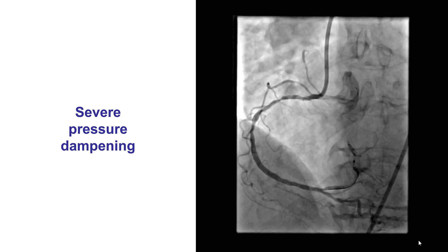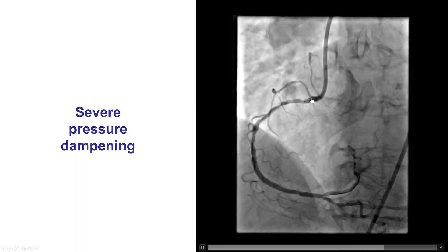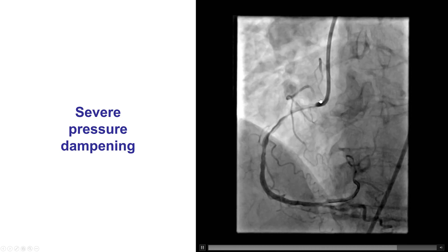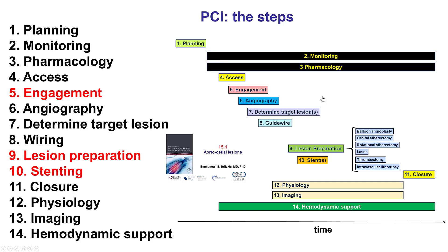This is the diagnostic angiogram. This is a right coronary artery with significant disease in the proximal and mid-segment, extending all the way to the ostium with severe pressure dampening upon guide catheter engagement. Dampening is one of the challenges with treating aorto-osteal lesions. There is a dedicated video, 15.1, for how to approach those lesions.